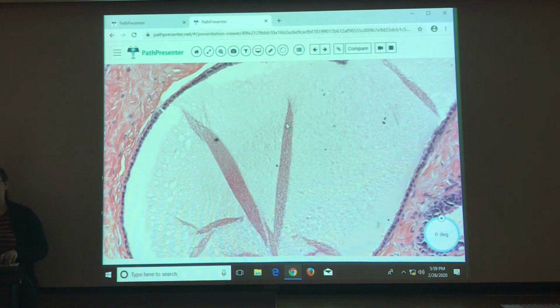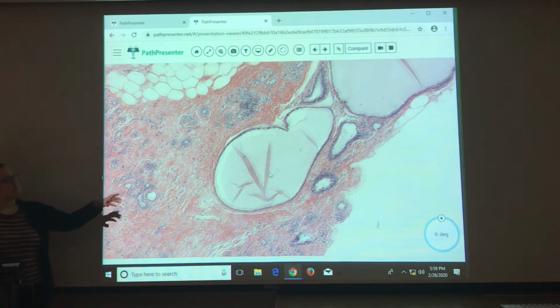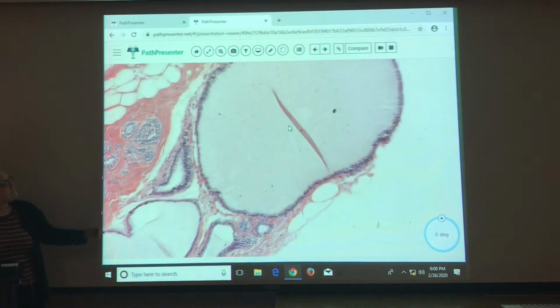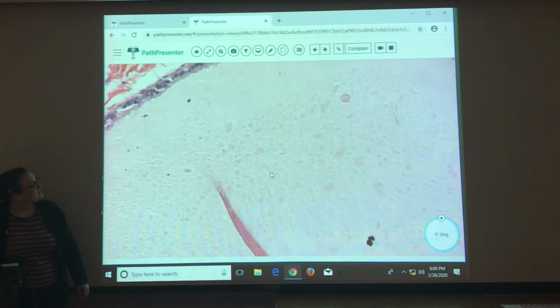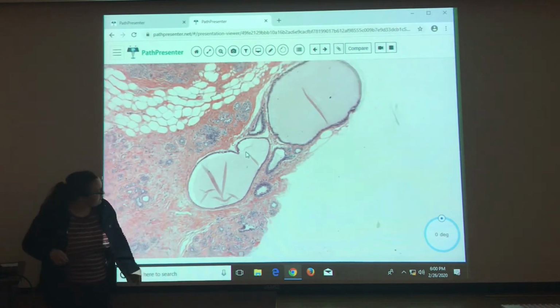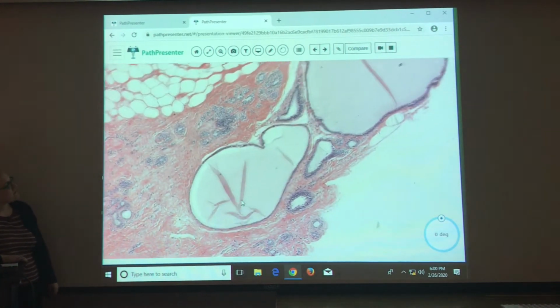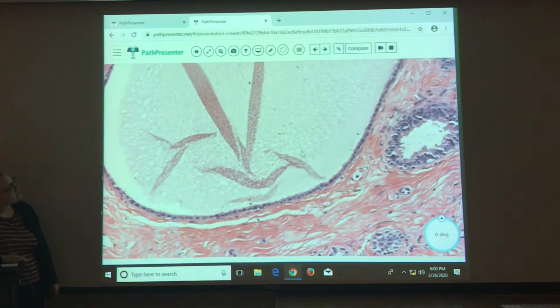So we call these mucocele-like lesions because we can't tell if there is maybe a mucinous carcinoma sitting around. If you had obvious atypia, then you could call a carcinoma. But if you just have things like this, where they're just filled with mucin and the stain maybe isn't the best. Sometimes you can even see a little bit traipsing out in some areas of the slide where some mucin has extravasated a bit. I don't remember if there were other spots on the slide.